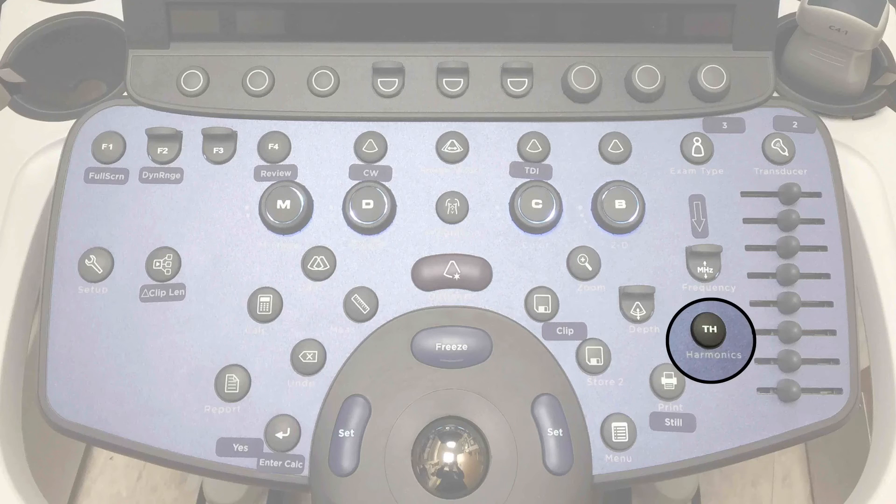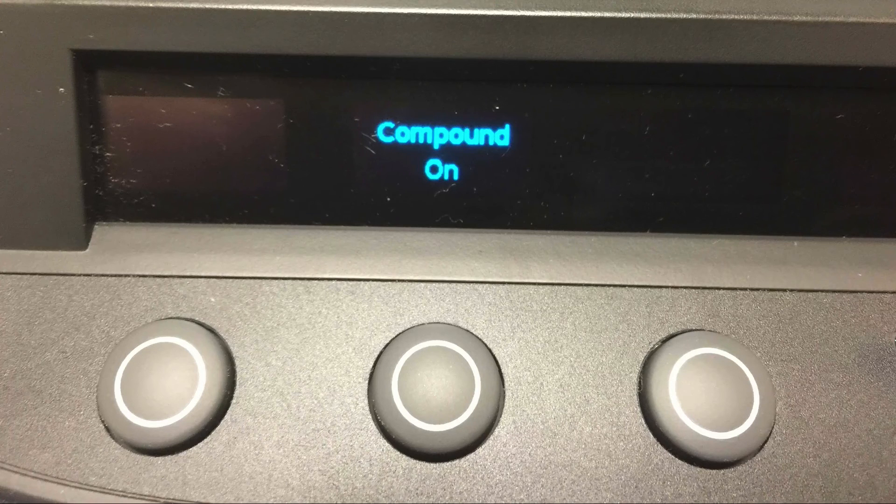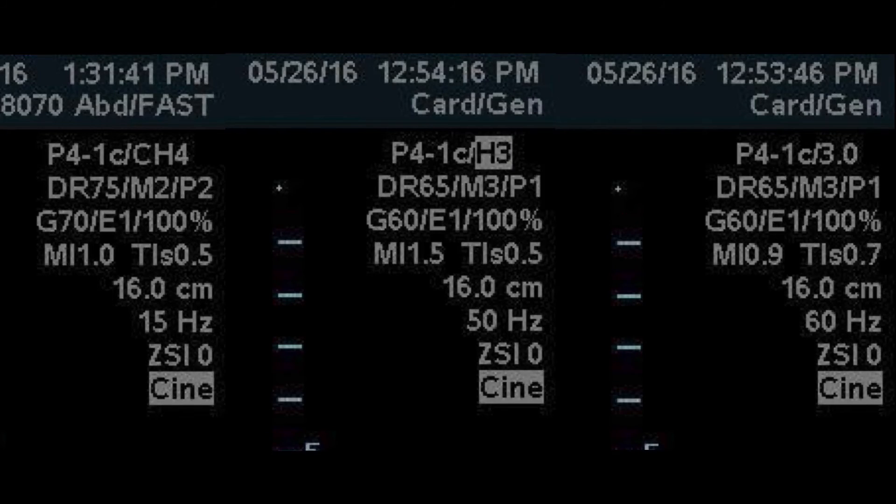You may want to turn off these post-processing features, especially when doing pulmonary or lung scanning. To turn harmonics on or off, press the TH button labeled harmonics, which is next to the time gain compensator sliders. Compound imaging is on the soft keys, and one of the buttons toggles compound imaging on or off.